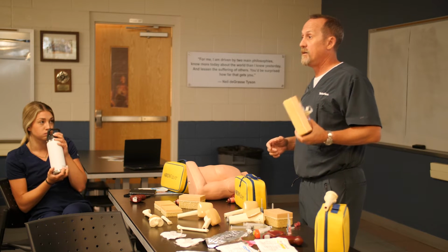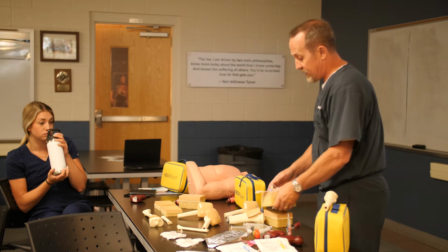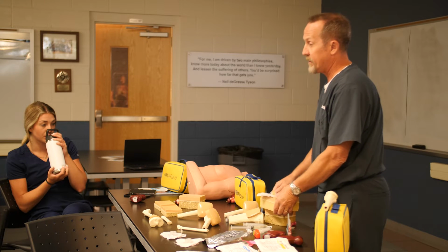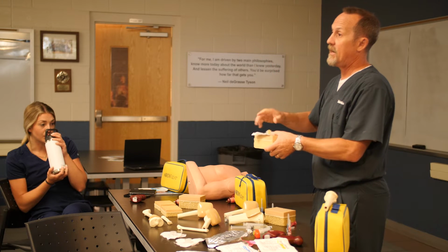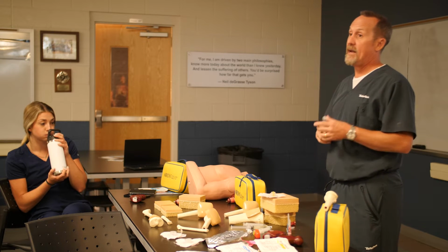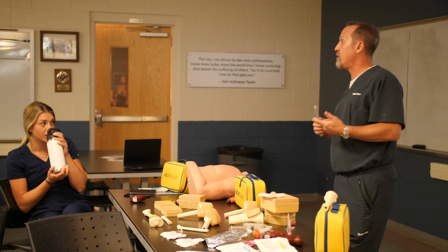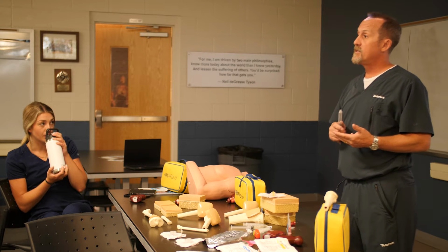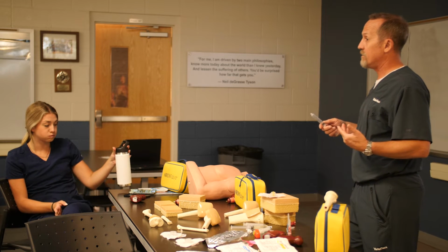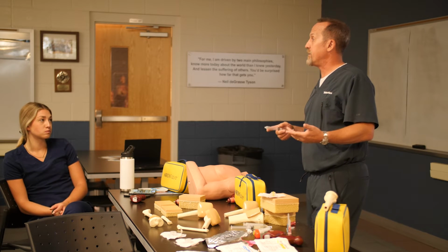So in that situation, we can actually use lidocaine, and we're gonna do that in a manner where we've inserted the needle, we put the catheter in, we've removed the stylet, we put the dressing on, and now we can actually administer lidocaine before we do the flush. Okay? This is very time dependent. So if you're in a code situation, a very emergent situation, sometimes you gotta hurt them to save their life. But if it's in a situation where you can slow things down a little bit, and we can administer lidocaine to reduce the pain the patient feels, then we'll use lidocaine.